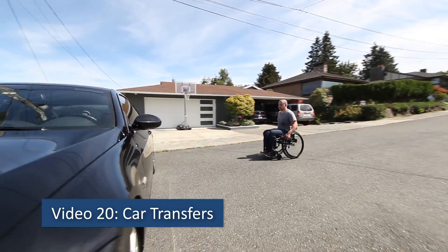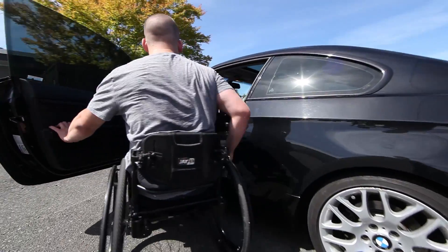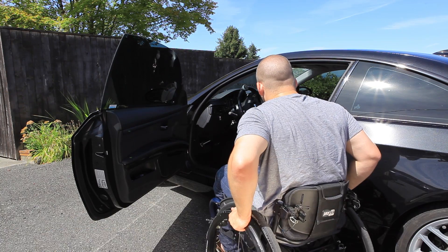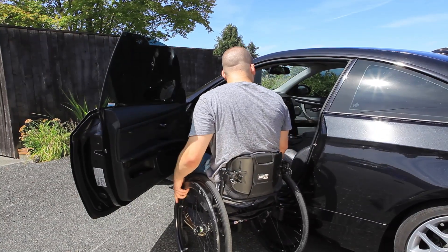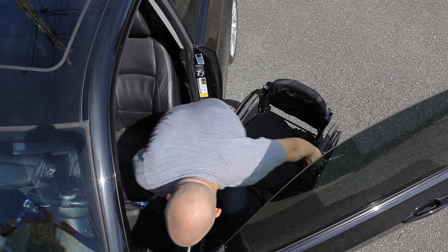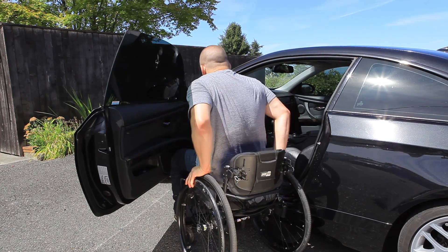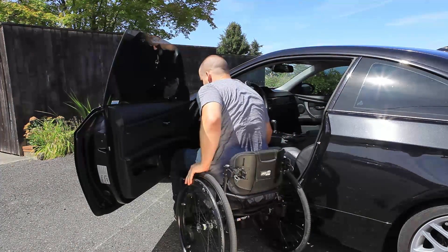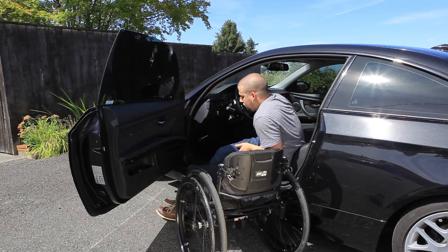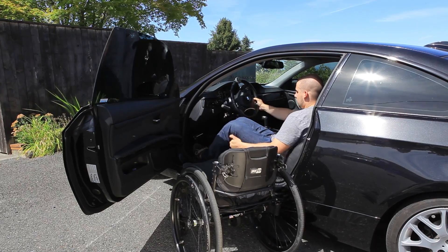Video 20: Car Transfers. The ability to get in and out of a car will give you more freedom and allow you to be more independent in your community. This transfer is challenging because the gap between your wheelchair and the car seat is wide. The seat heights are different and the door frame limits your ability to lean. You will also need to weigh your options for the best handholds in the car.